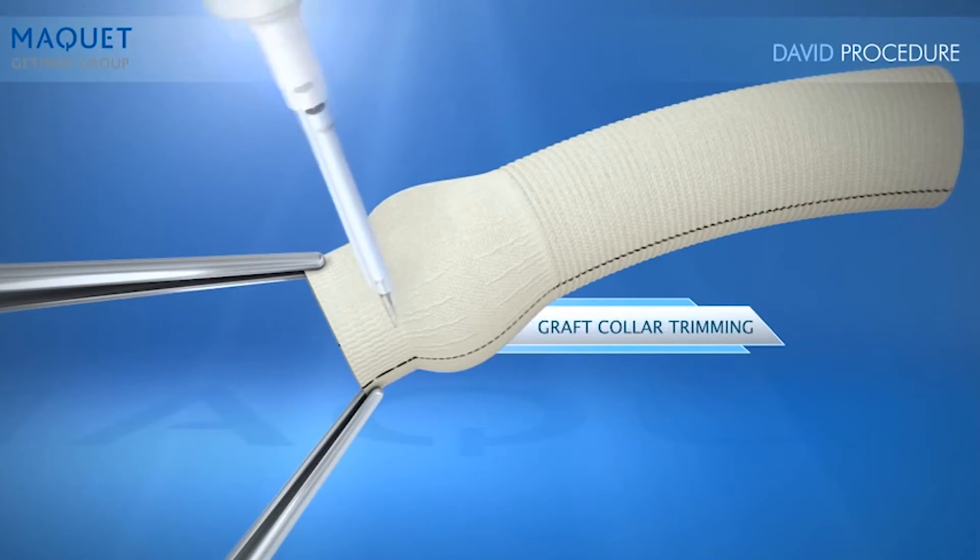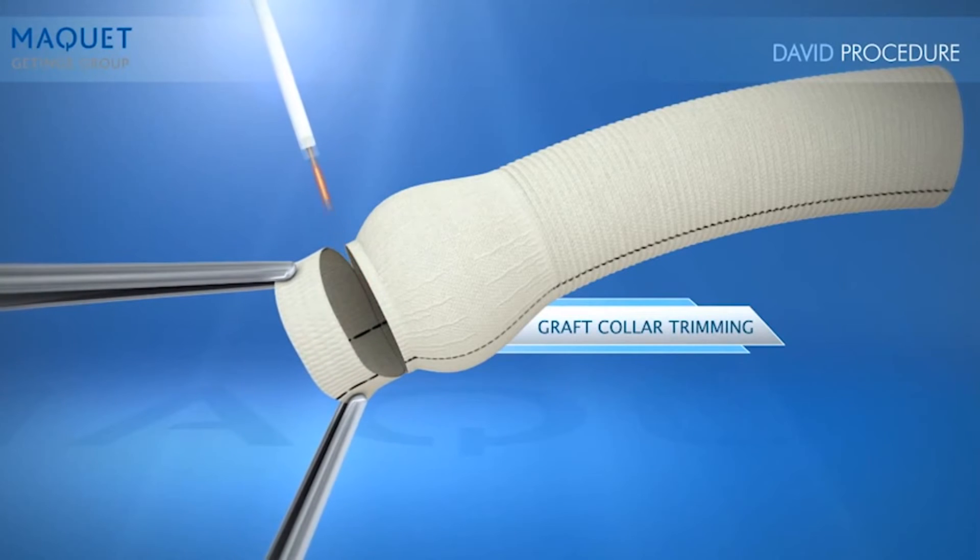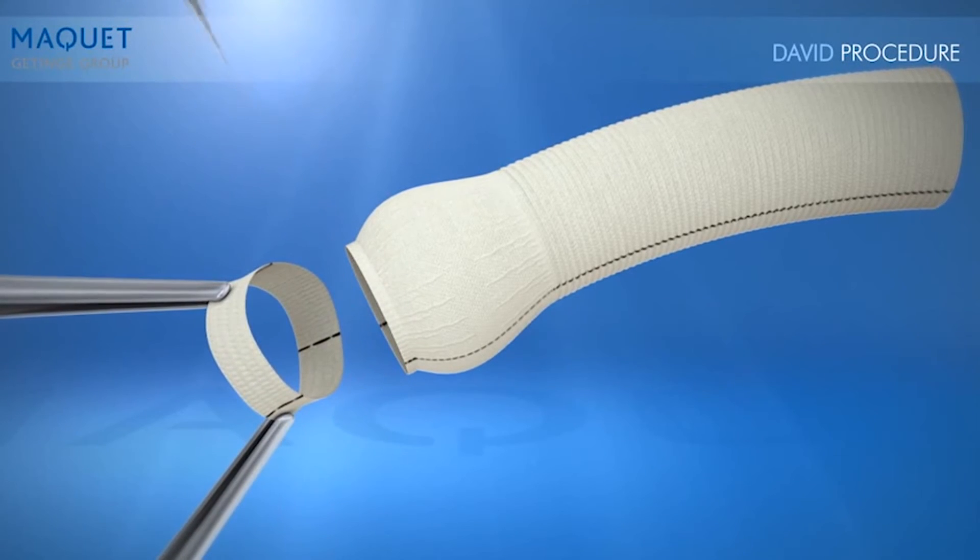During this step, the anatomically correct shape and the uncrimped proximal collar of the CardioRoute make it easy to handle, measure, and trim.